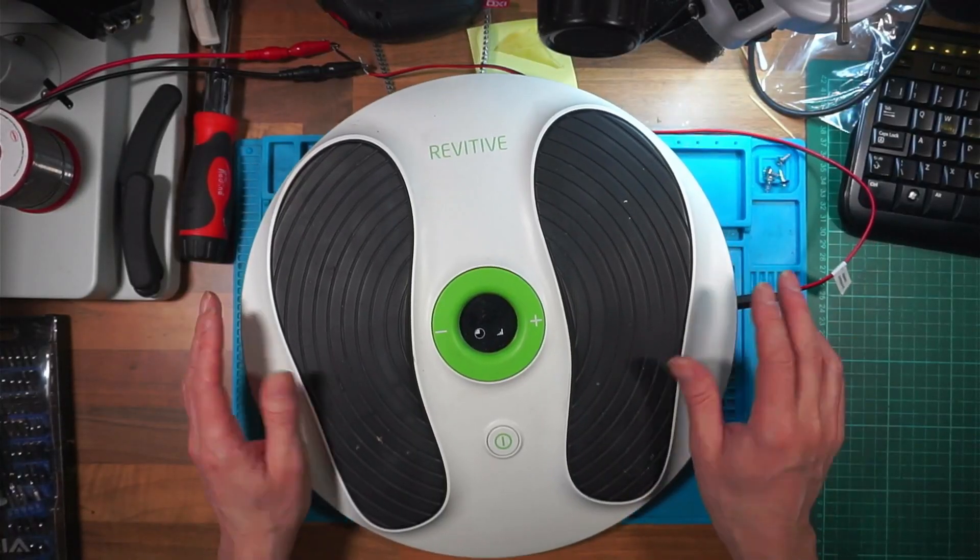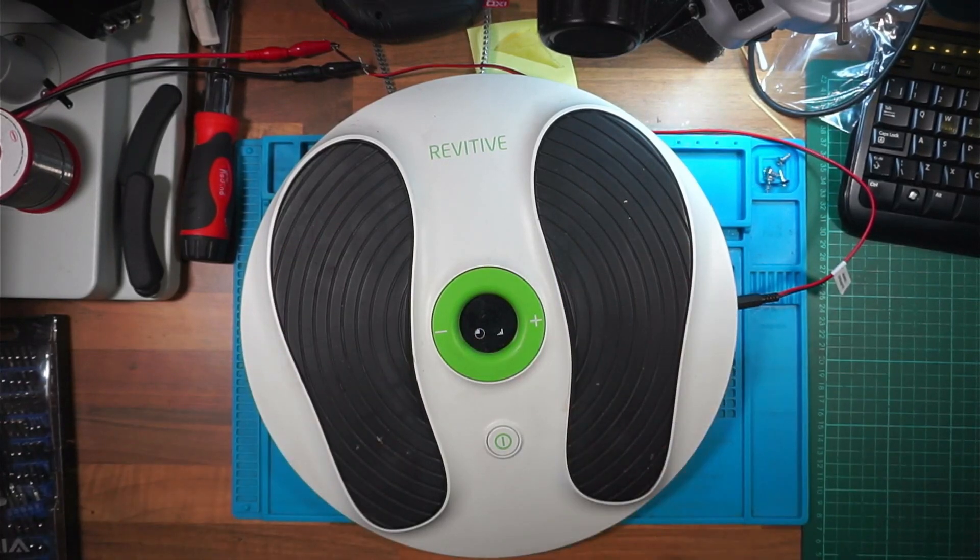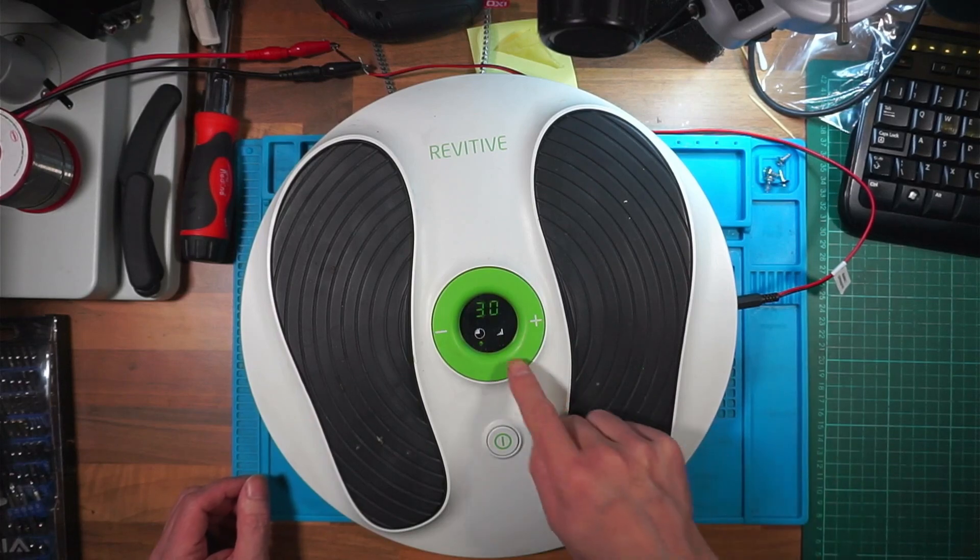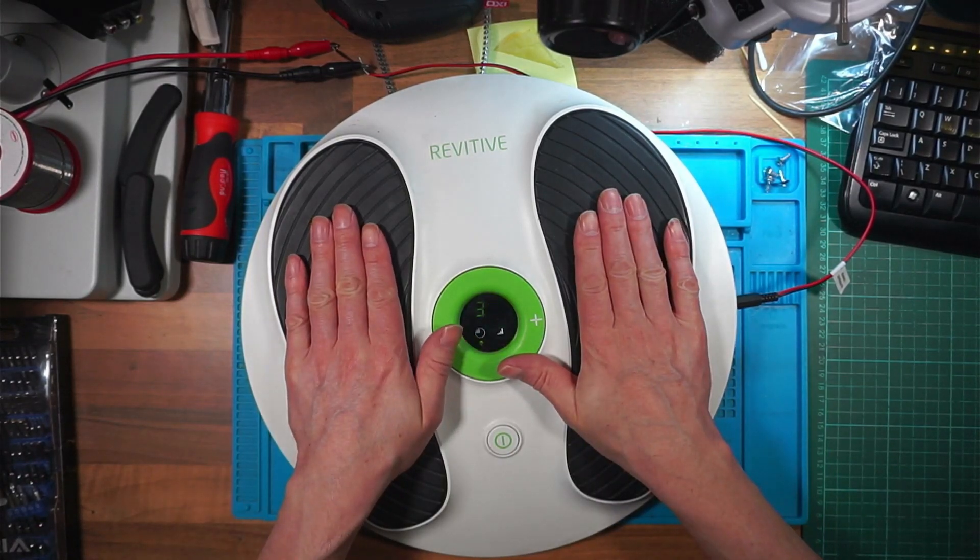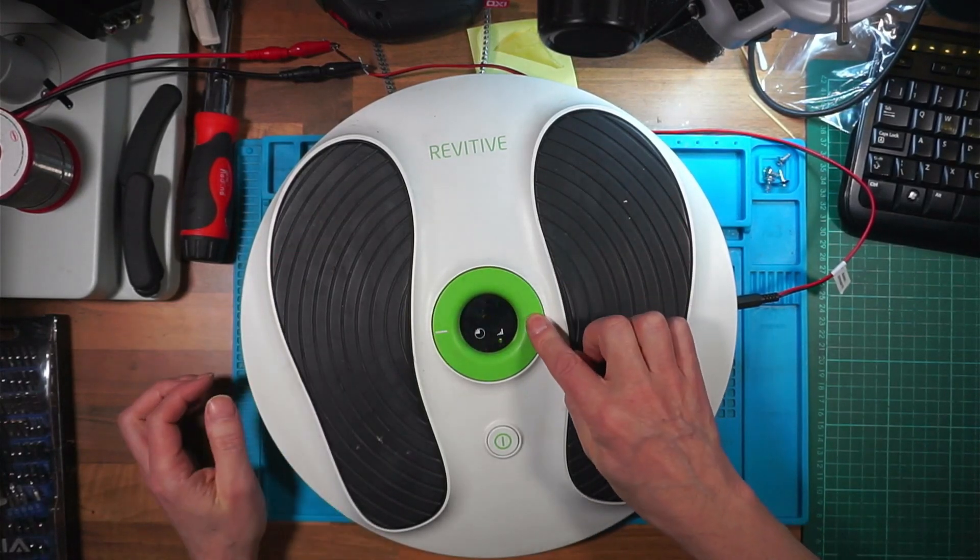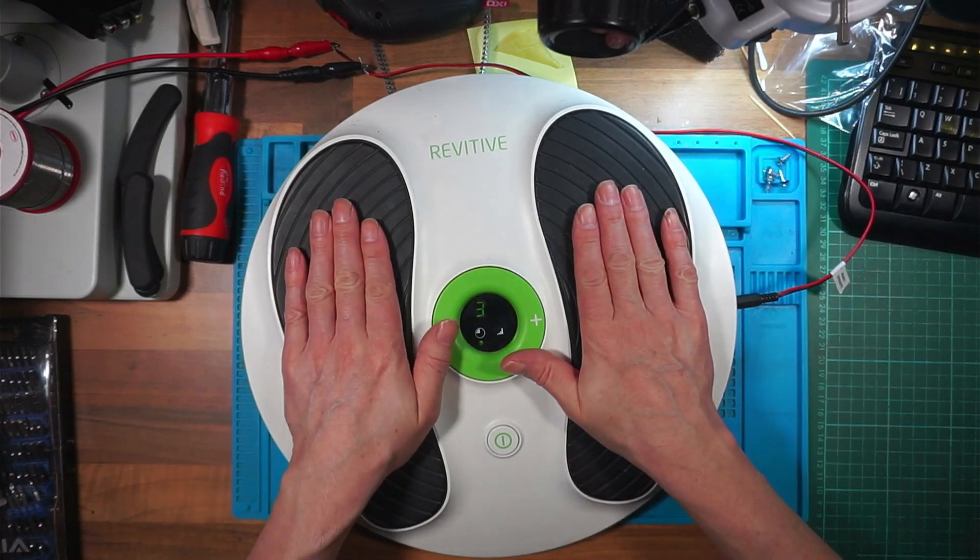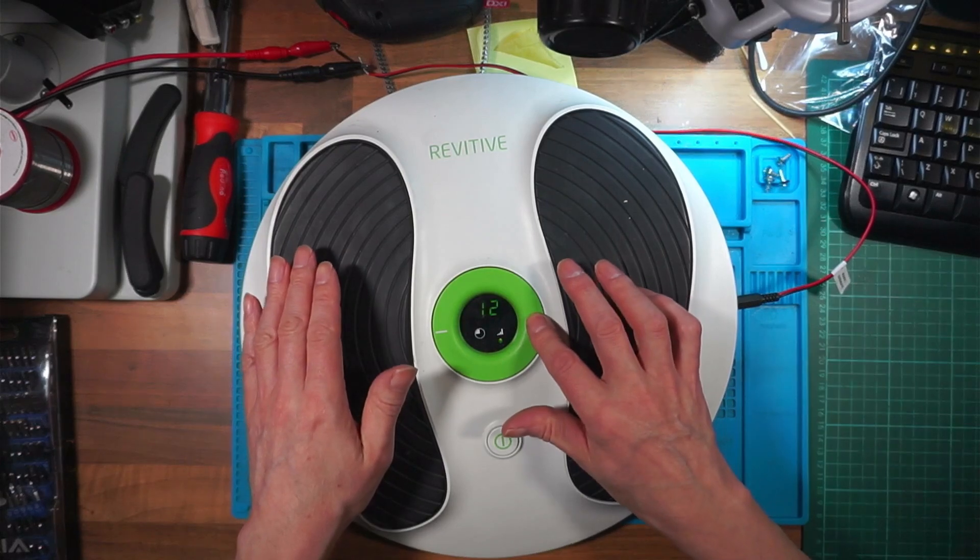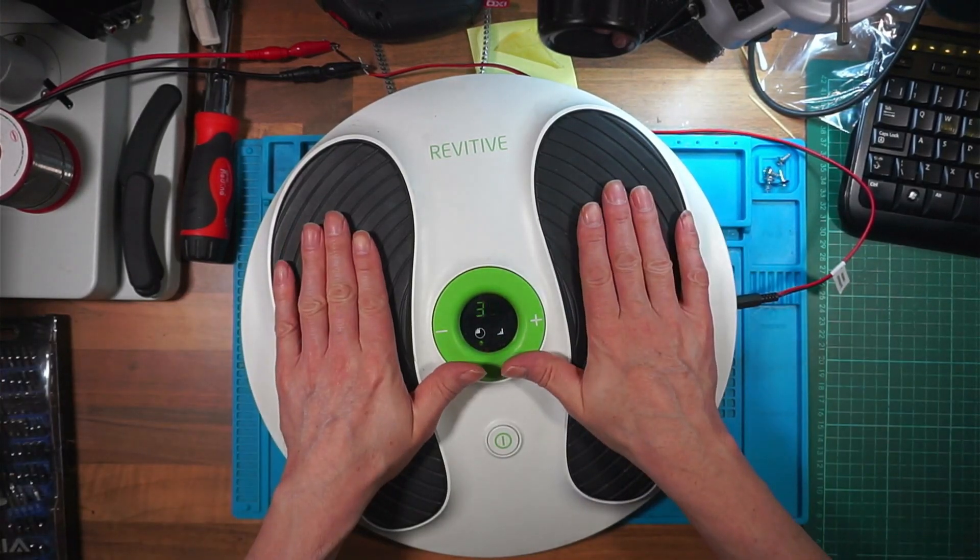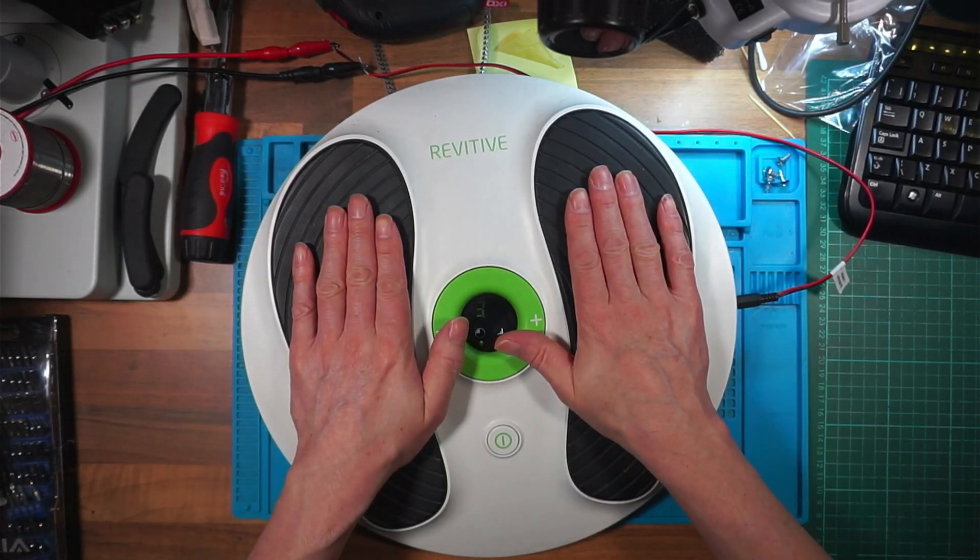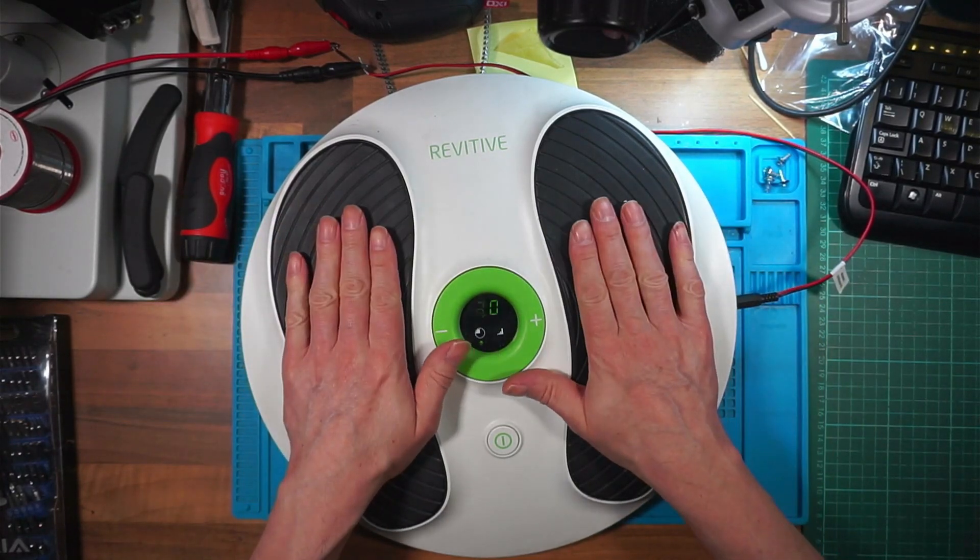Right, well that's back together. I haven't put the screws in, but we'll power it on. And we've got a 30, which we had before. Yeah, I can tell you, I can definitely, I can feel the shocks.